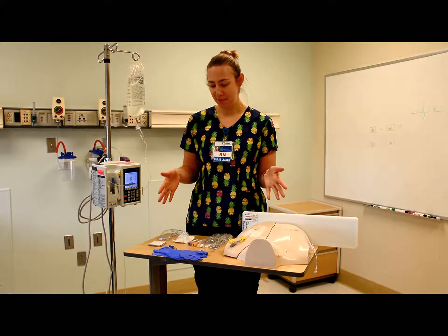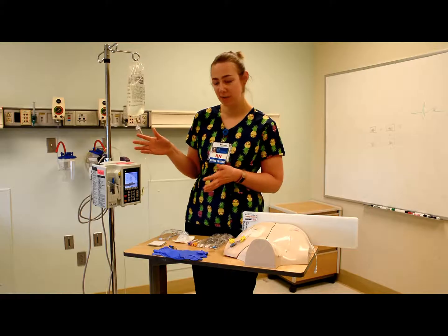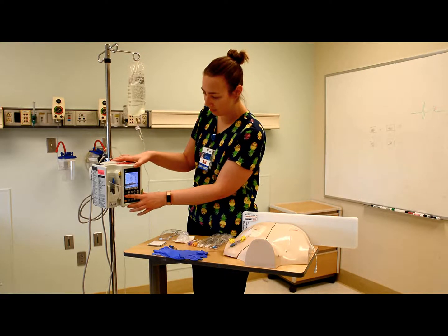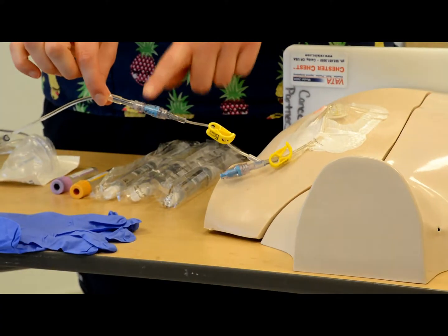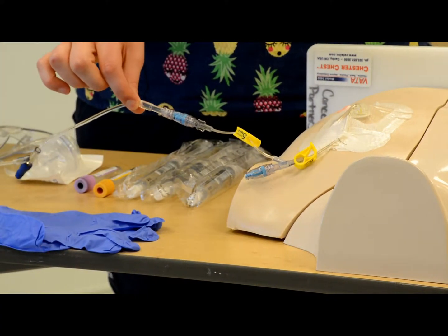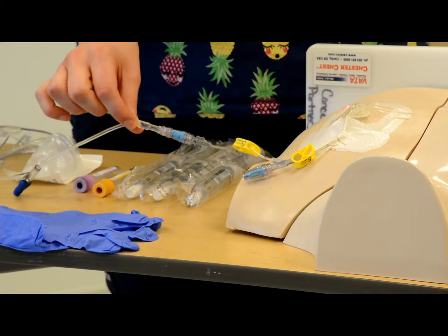So we've got our setup here, and before we start, make sure you stop your pump if you have continuous fluids running, so I'm going to do that, and clamp your tubing. Note that we're using the proximal lumen for any continuous fluids, that way we have the distal available for lab draws or IV push medication.